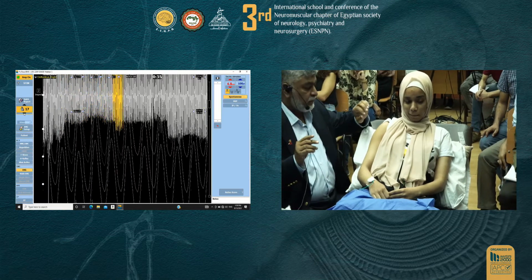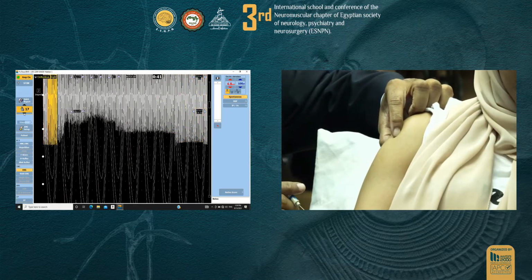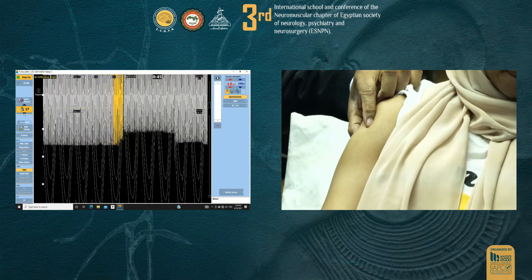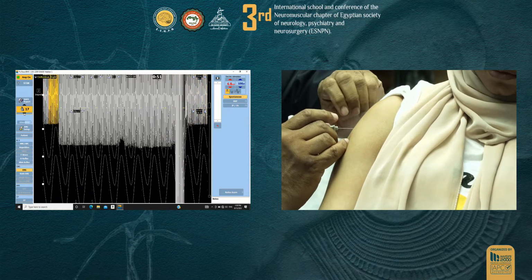Okay, you good? So stabilize the skin. I'm holding the skin tight so it doesn't move on the needle. It reduces the pain. Okay, grip it. So if you stabilize the skin, the needle movement, okay, just one sharp movement, and you go into them.